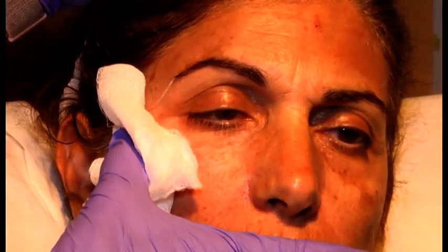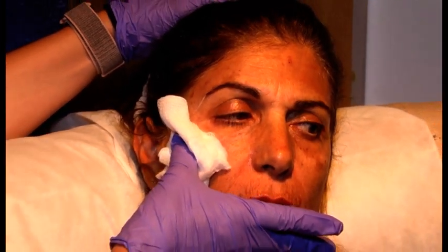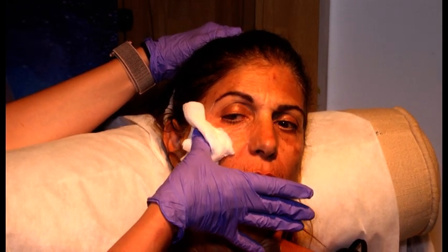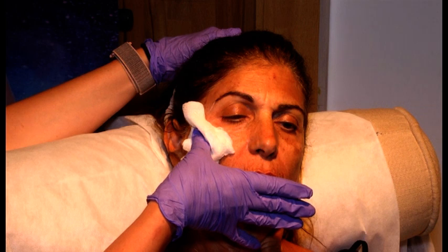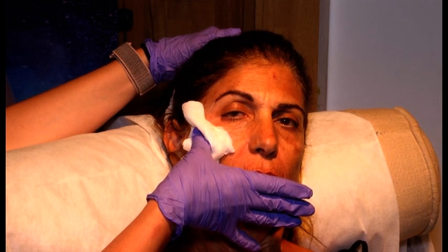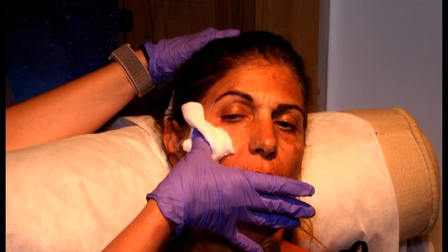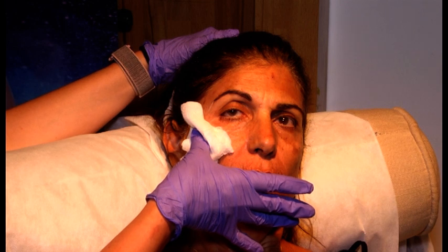It's really swelling now, so maybe you can put some pressure. I might have hit her zygomaticofacial artery, because there's a little foramen down there with a nerve and an artery. I was trying to hit the nerve with the anesthesia, but probably I have also hit the artery. So for anesthesia, it's good, but for the bruise, maybe not.